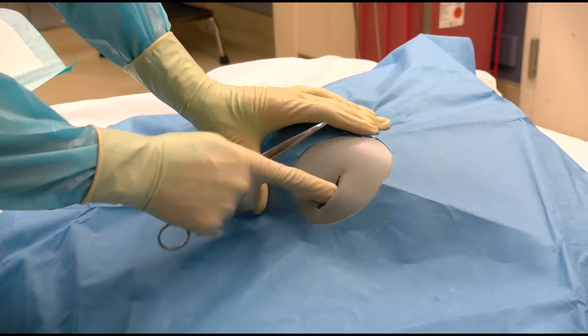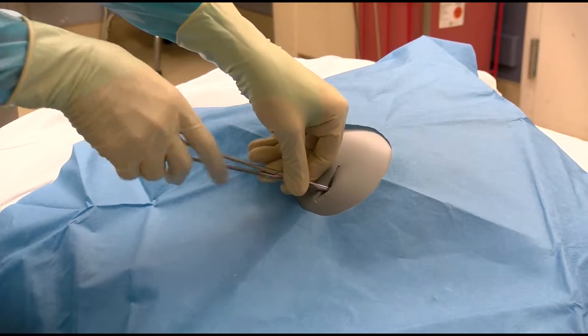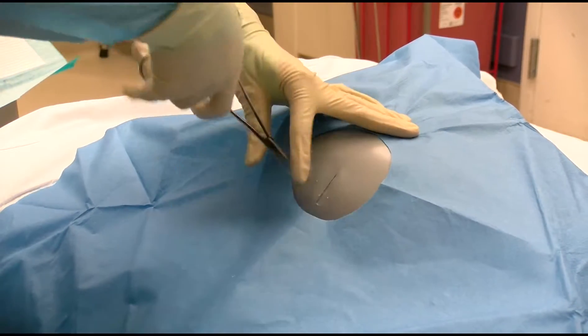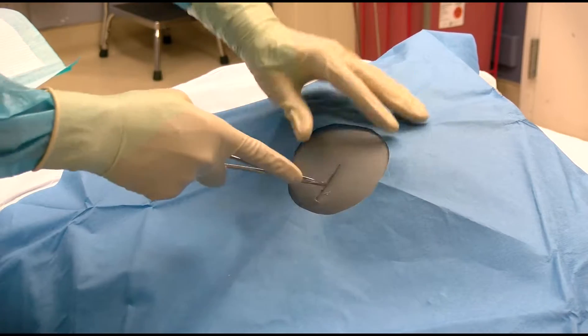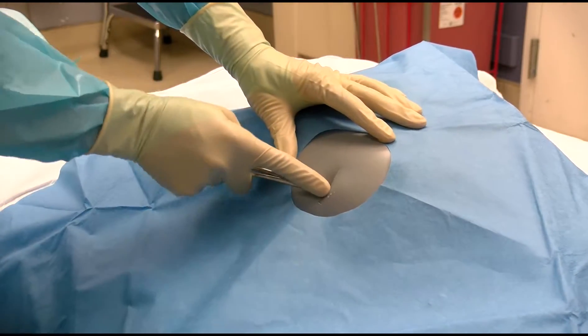Position the hemostat above the rib to prevent damage to the neurovascular bundle that runs below it. With a firm grip and pressure, puncture the intercostal muscles using the curved hemostat, being sure to use your finger as a stop to prevent uncontrolled deep insertion.